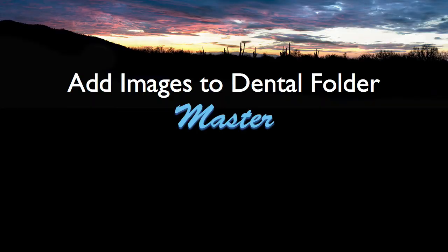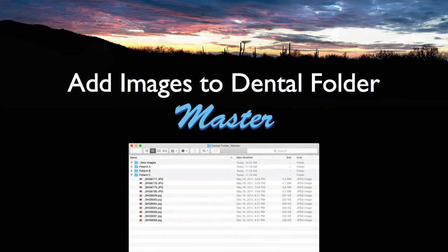So what I've done for this example is I populated the patient folders A, B, and C with images, which would be what you're going to do once you get your images all in one folder. So I took images for patient A, B, and C and placed them into their corresponding folders. And now what we're going to do is import those images into Lightroom. And again, when I say import, we're adding them to the Lightroom catalog. We're not moving them. So they're going to reside in that dental folder master underneath their particular patient names. They're not going to be moved.